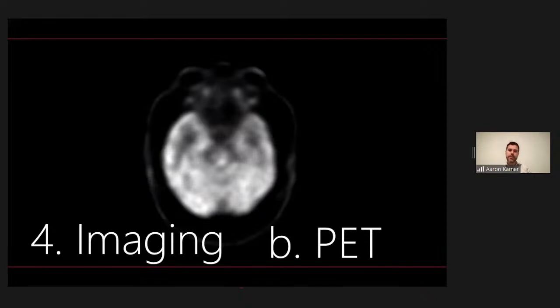The abnormalities that we see, I've found PET not to be super high yield in my practice, but we are also evaluating a lot of patients who are already MR negative. So oftentimes PETs are done in collaboration with the neuroradiologist, and there's a discussion that happens about findings that are visible on the MRI and how that compares to the metabolism that's imaged on the PET.